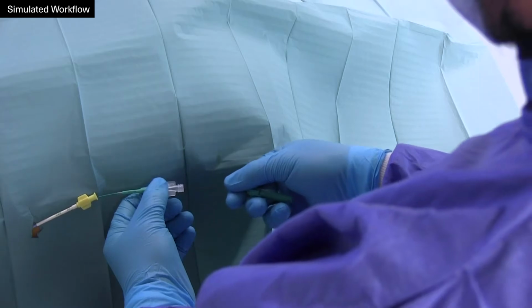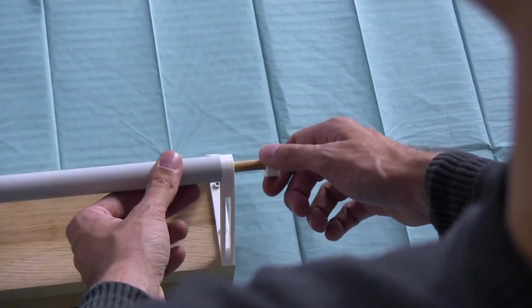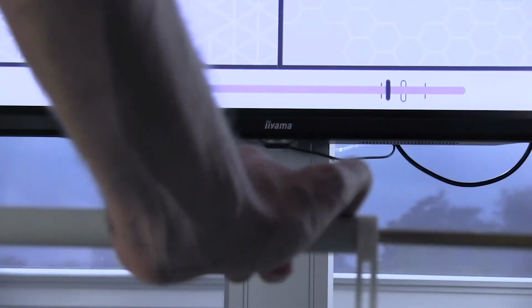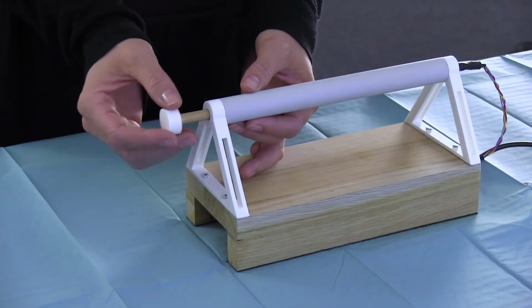Even though a medical scenario served as an exemplary scenario in this work, the tasks were abstracted in a way that no expert knowledge is required. The manual movements of a radiologist are to be imitated using the example of a guidance of a catheter in a vascular structure during an intervention. We simplified this task to forwards and backwards movements and created a prototypical input device. An abstract visualization in form of a horizontal bar displays the user input and a target marker.